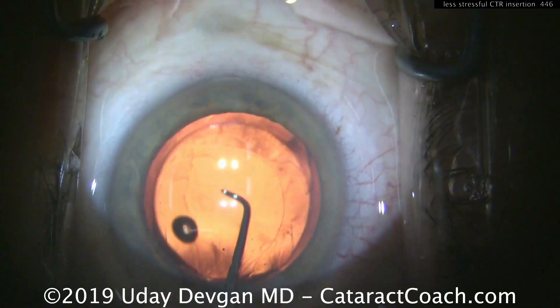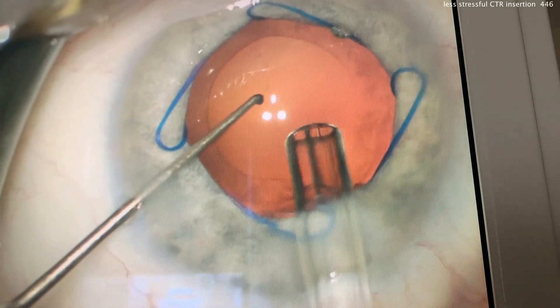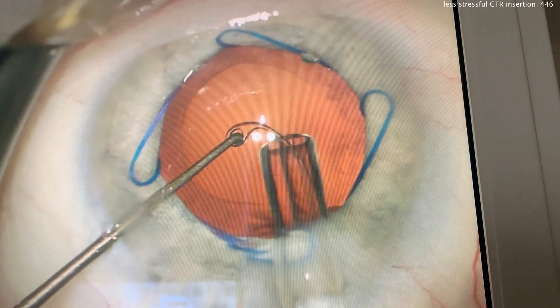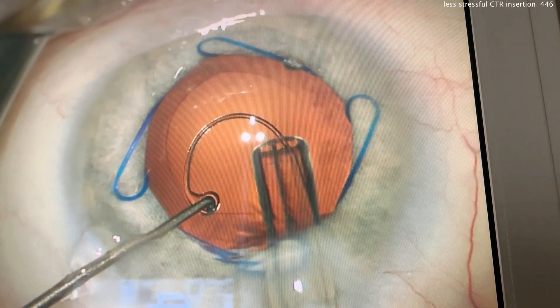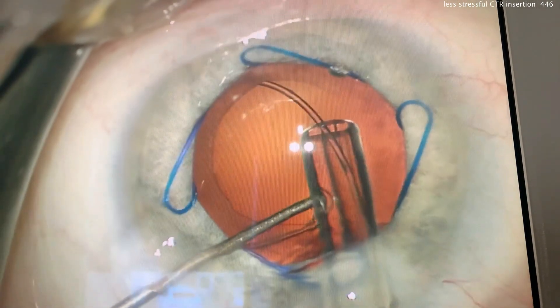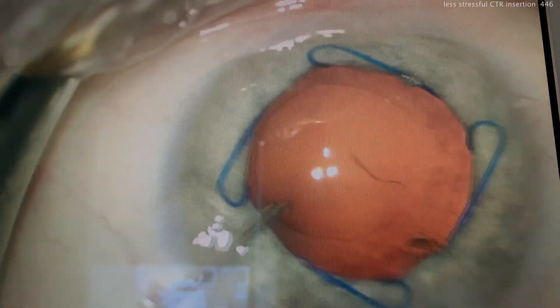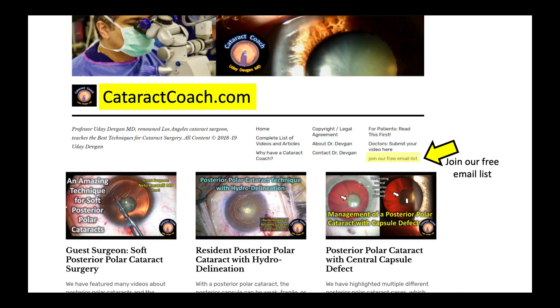Again, this is using a Sinski hook to help guide the CTR. The Sinski hook is holding the leading eyelet; it's slowly advanced and curled into the eye, and it can be placed up against the capsular bag equator with no stress. Then simply release.